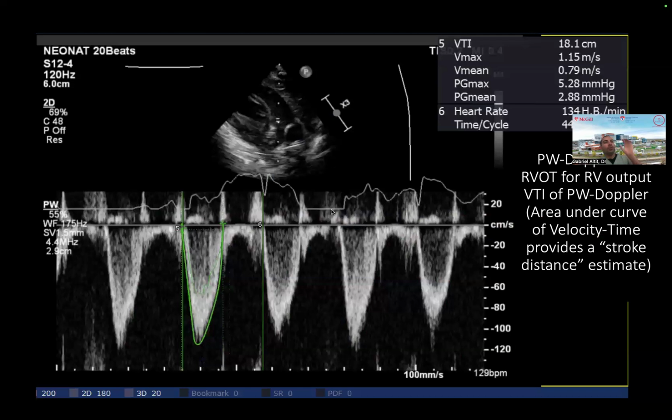Typically, if you have severe stenosis, first of all, your gradient will be much more than 2 meters per second, except if you have complete atresia or blockage, then you just don't have any flow, so you don't have any gradient. That's the first thing. Second, typically you'll see the caliber of the artery to be very small on your 2D views and your mustache view.